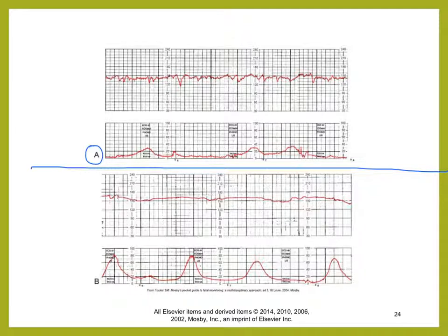So when we see a contraction, we need to know if there are 3 uterine contractions in 10 minutes, same strip, same time framing, 1 square 10 seconds, 6 squares or between the 2 dark lines is 1 minute, and it's about a 12-minute strip. So we need 3 uterine contractions in 10 minutes with no late or significant decelerations.